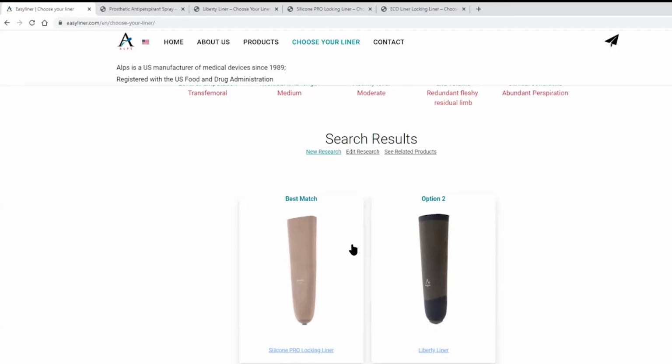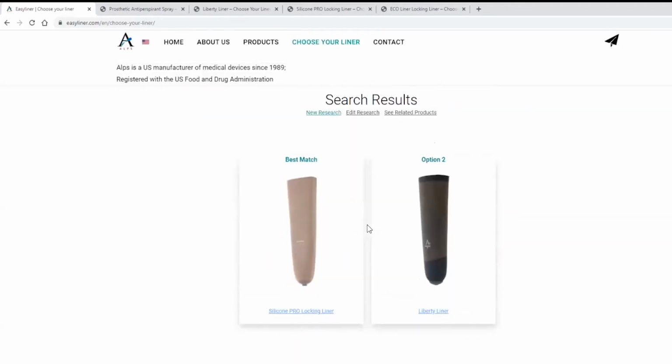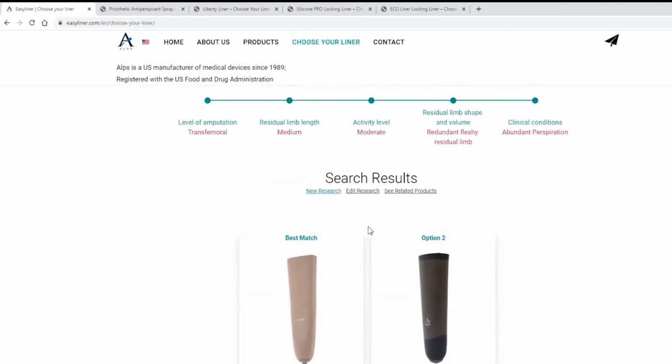We're trying to be inclusive with all of our selections here. Yeah, in terms of if a clinician chooses to use vacuum versus pin, does this program also allow the clinician to decide on that based on the type of suspension that they choose? I'm glad you asked that, Liz.